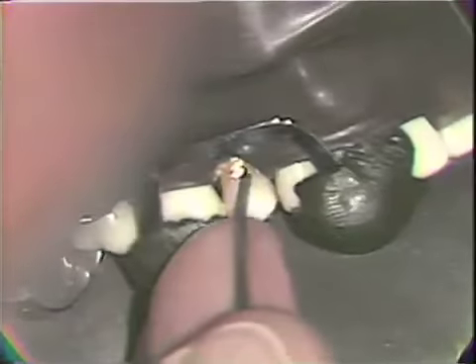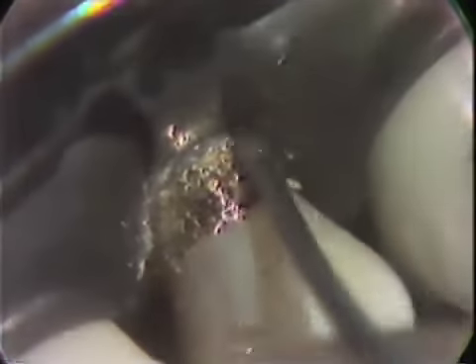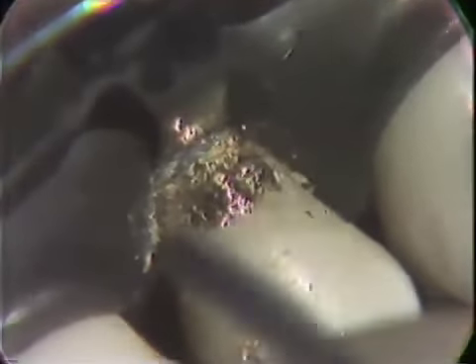Care must be exercised here that we don't denude the cemental surface in this area because of the type of hypersensitivity that this tends to then create. We can also use that off into the mesial area slightly. Again, just exposing that margin, the slight excess contour that we have at that point.